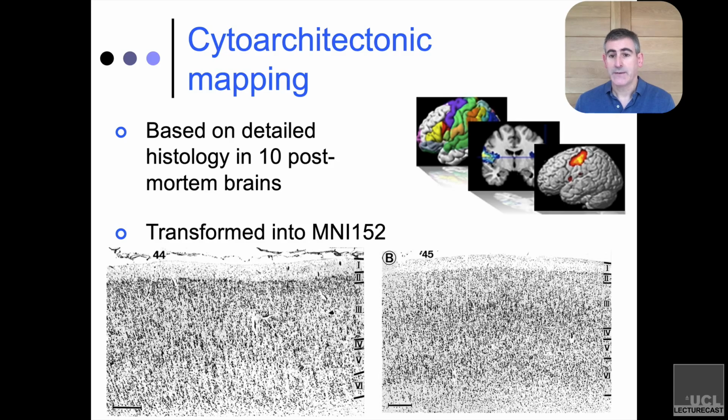As a result, they haven't done it for the entire brain yet. As years go on, we're getting closer and closer, but it might mean that an area that you're particularly interested in may or may not be one that they've gotten to. The SPM Anatomy Toolbox is basically from the Zilles and Amunts group, and I think it's Eickhoff who's the first author on these. But that represents the latest, greatest probabilistic cytoarchitectonic maps.